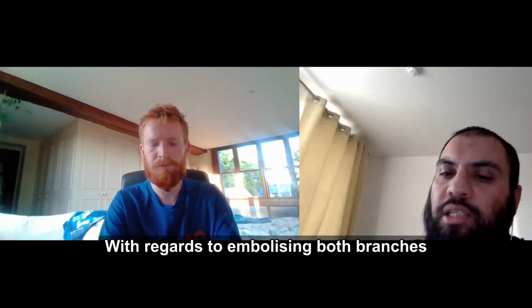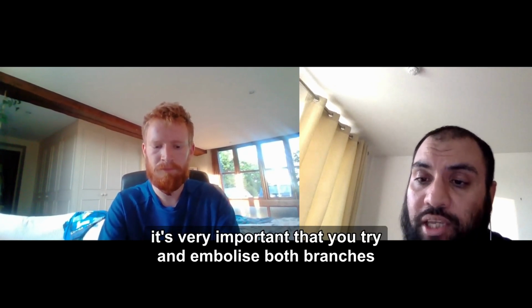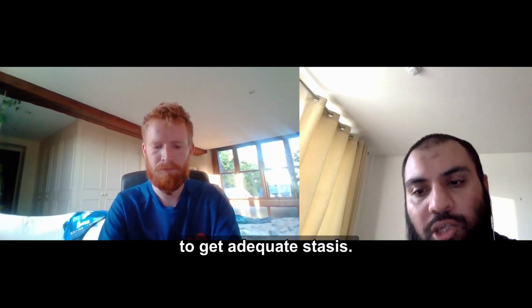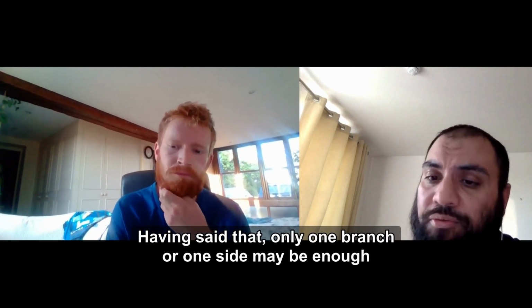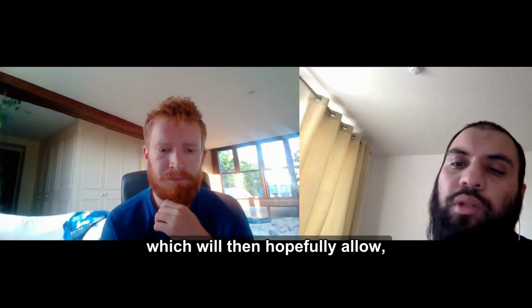With regards to embolizing both branches of prostate arteries, or whether one branch is enough, that's a very good question. Speaking to senior colleagues and having limited experience, it's very important that you try and embolize both prostate arteries on each side to get adequate stasis. Having said that, only one branch or one side may be enough if there's cross-filling. You might get a branch going across both hemiprostates.